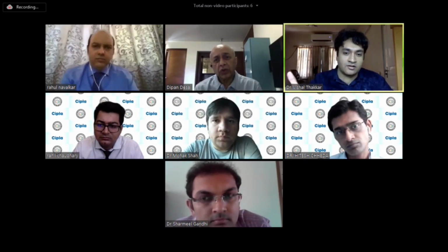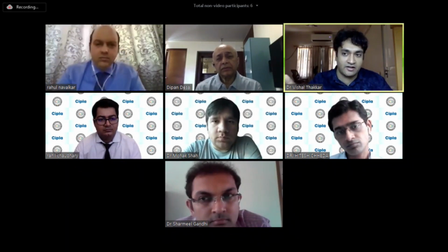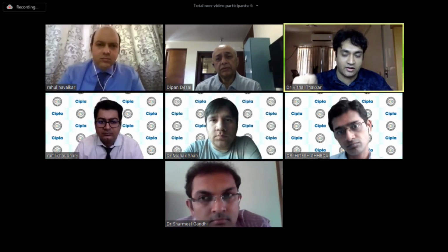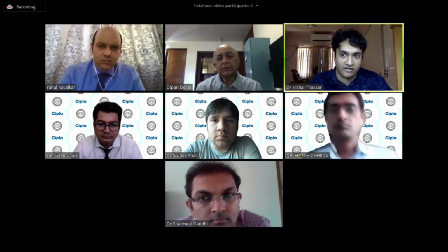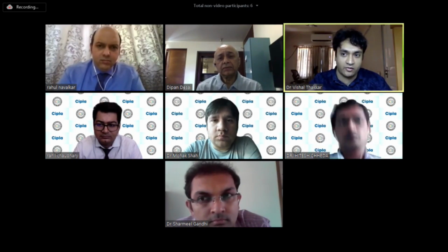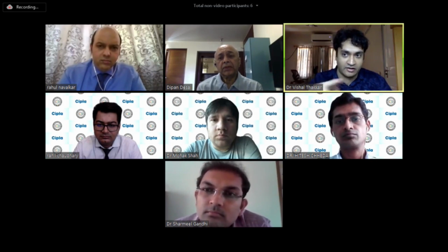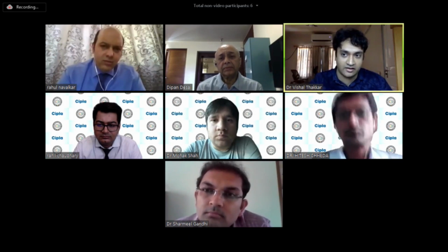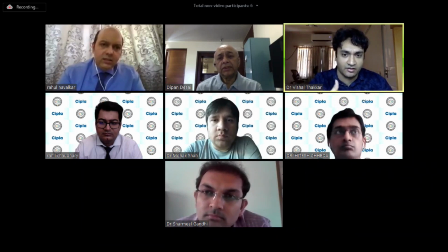So usually what the Callisto does is when you do your biometry with the IOL Master 700, it takes your iris photograph, your limbal vessel photograph then and there. And you have to match that photograph with your intraoperative Lumera photograph before you start the surgery. So before you do any conjunctival manipulation, when the eye is virgin, you match these things. So there is usually no problem with these systems.